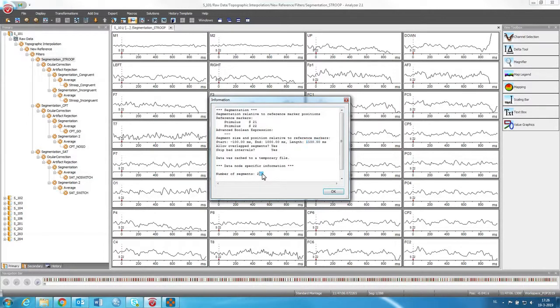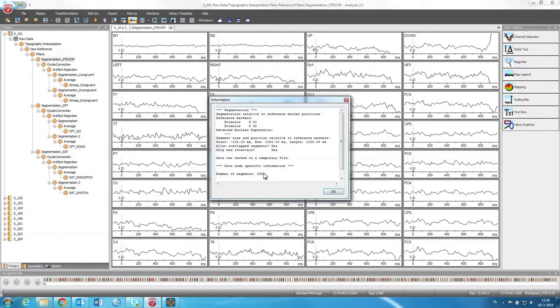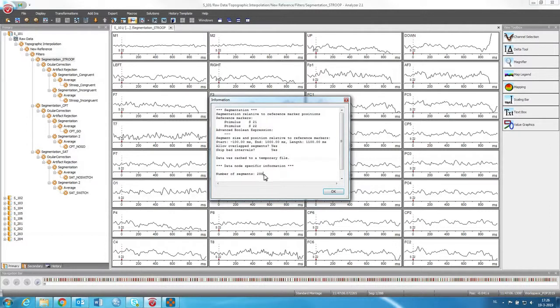And then here you can also see how many trials or how many events or epochs were selected for these participants. So this participant in the data had 288 trials available.